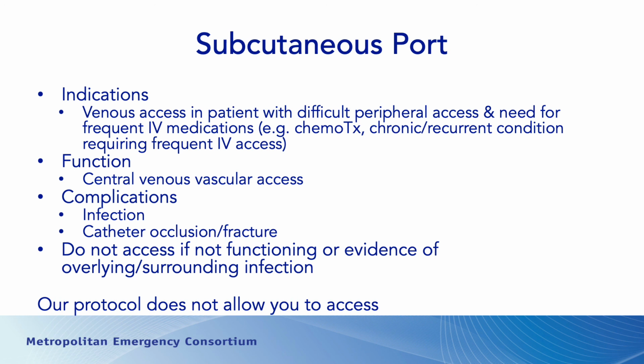So if you see in your community that there's a big need to have access to these devices, talk to your EMS coordinator and see if they can make a good argument that we should look at putting these back into the protocol. But I do want you to be aware of them. And the last comment is we should never access these devices if there's any evidence of malfunction or if there's overlying infection.